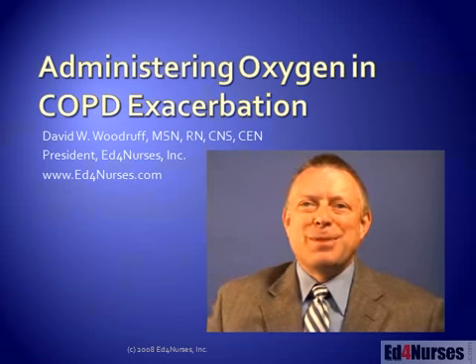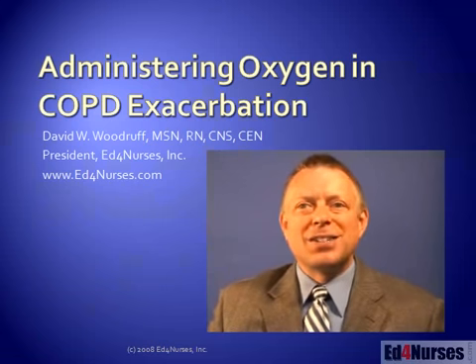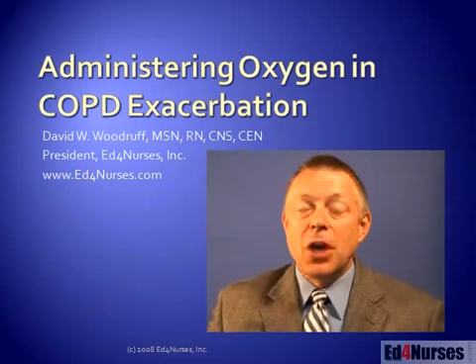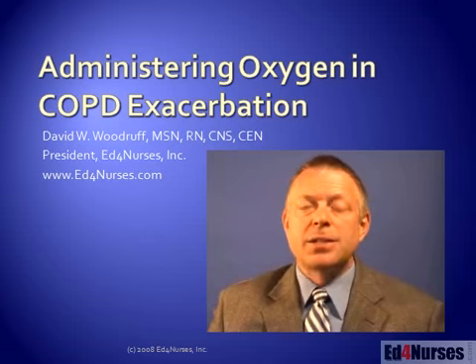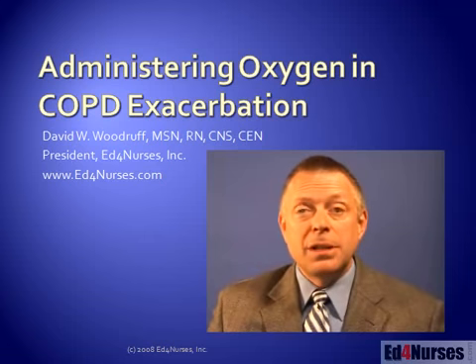Nurses often ask me, what is the appropriate amount of oxygen to deliver to a patient who has COPD? This is a complex issue and involves both oxygenation and CO2 and the possibility of CO2 retention.